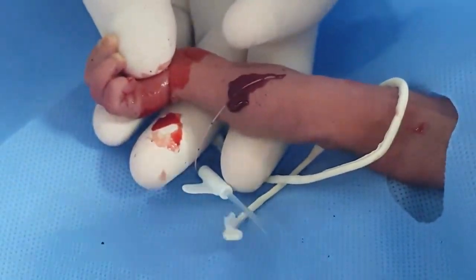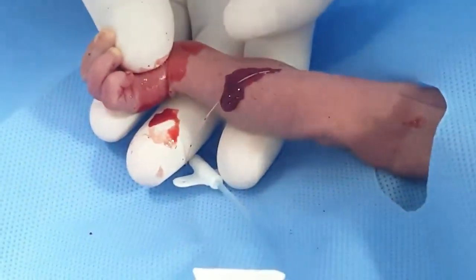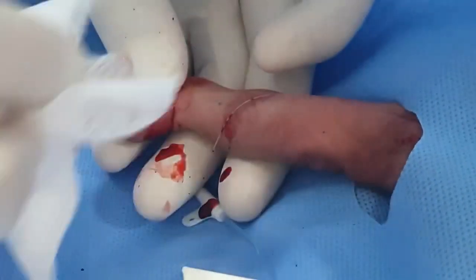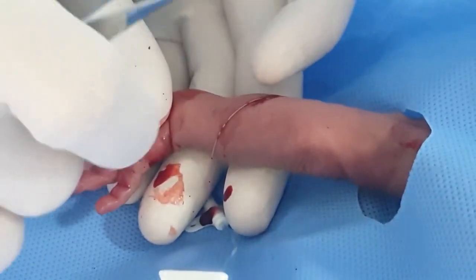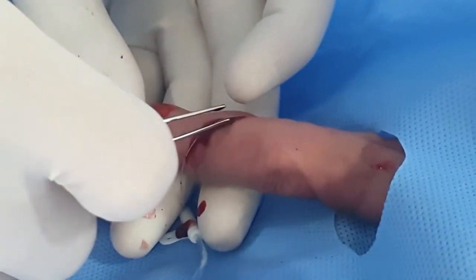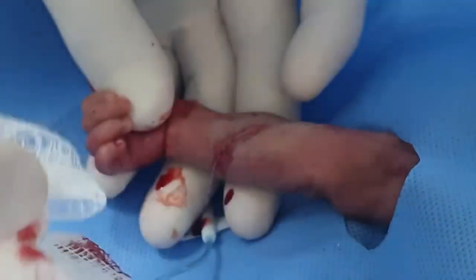We are now at the 3rd mark — 15. And this is 14. So we will keep it at 14 cm. Then we will do an X-ray to check the position.